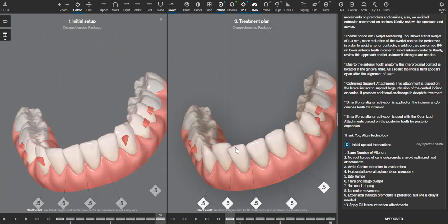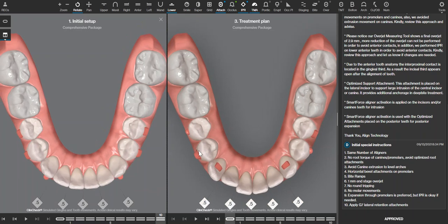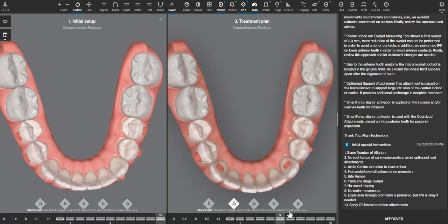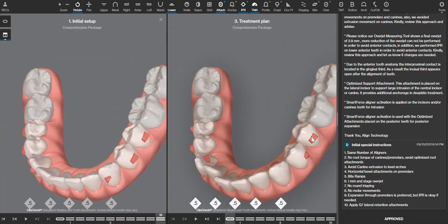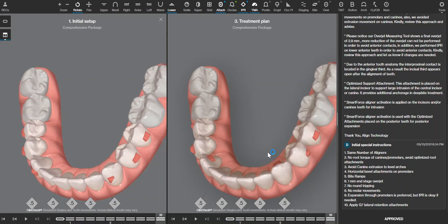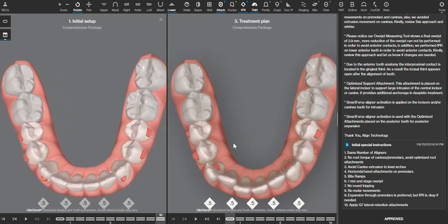Looking towards the lower arch, I don't often rotate lower premolars, but these premolars actually do seem to take up more space in their starting position than if we were to rotate them. So there's a rotation attachment on 29. 20 is also rotating, but it doesn't have the rotation attachment. So it's possible that this tooth still may rotate, because it has some attachment on it, even though that's not the best attachment designed for that type of movement. But we'll see how this goes along.